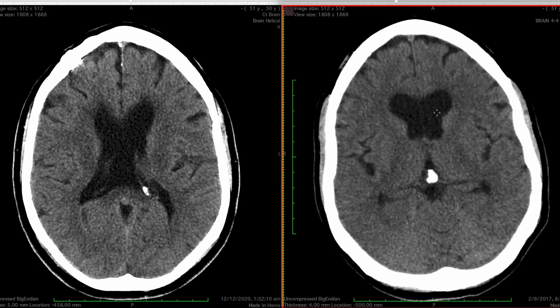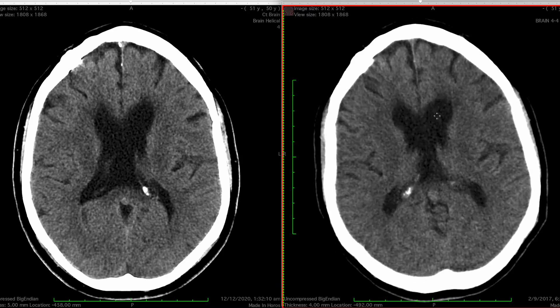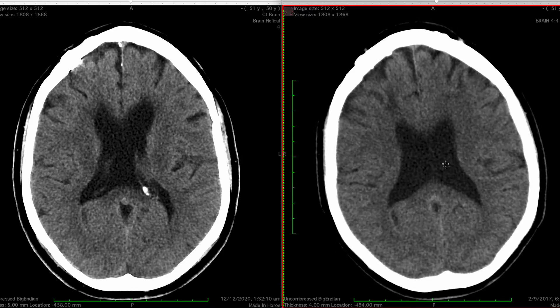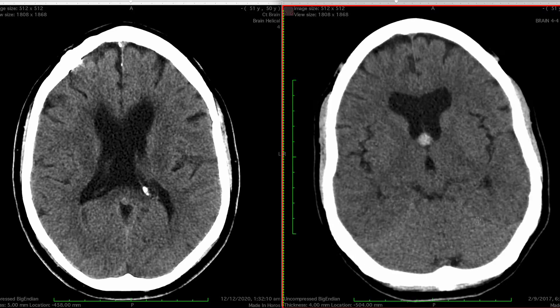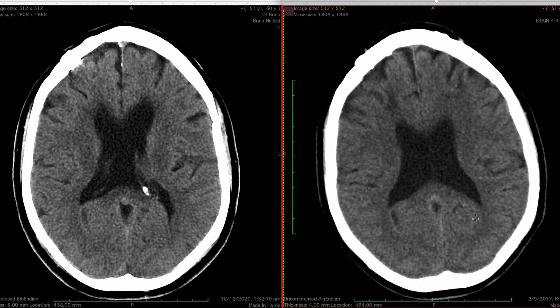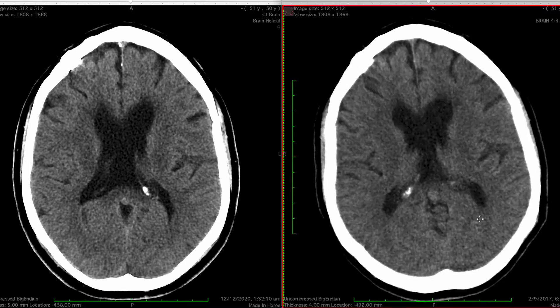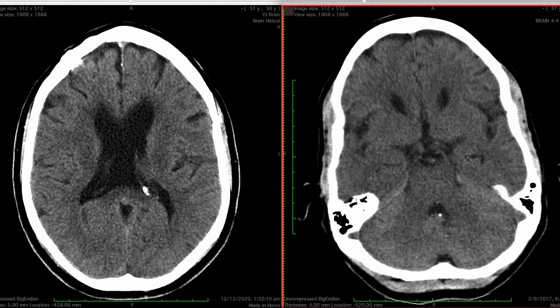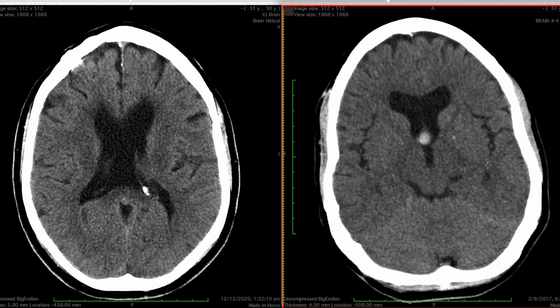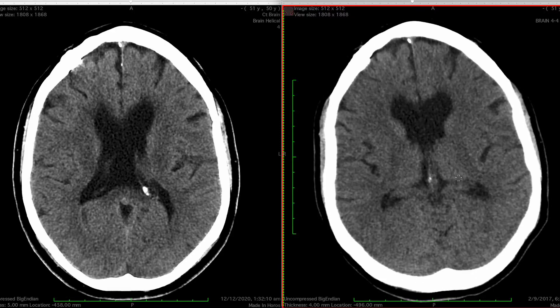You can see the frontal horn of the lateral ventricles here, the body, the trigone — the occipital horn is not dilated. And these are the temporal horns, and they are certainly not dilated. So we can be confident to say that there is no acute hydrocephalus.